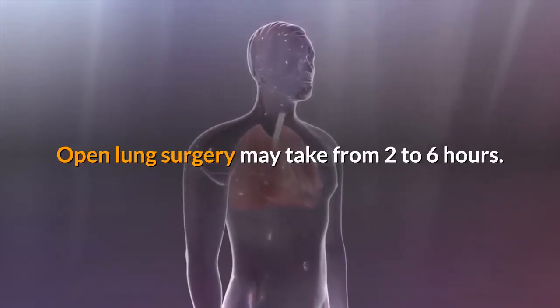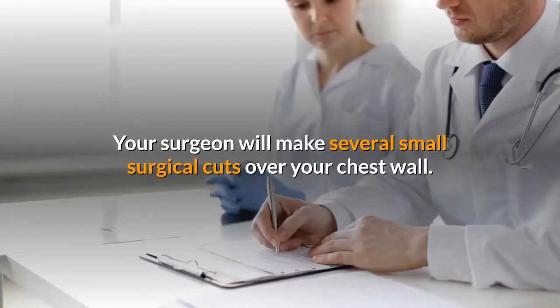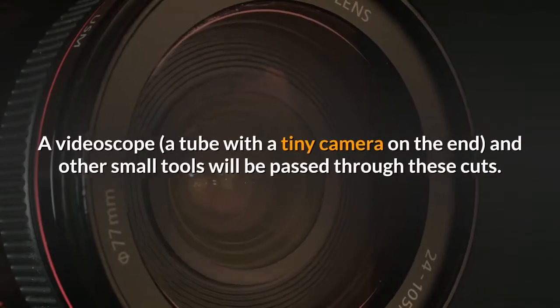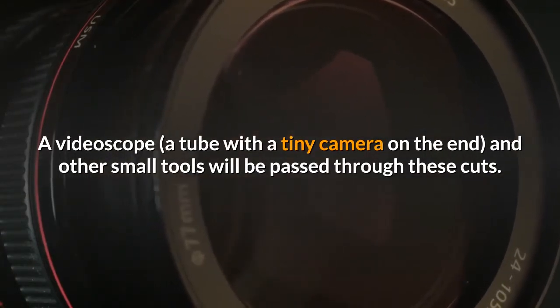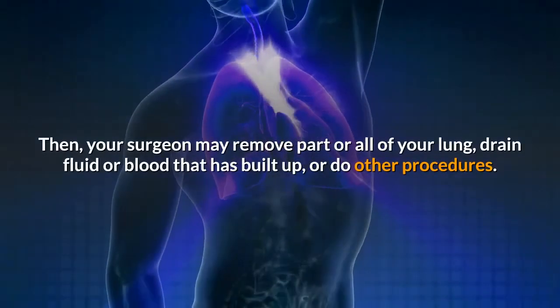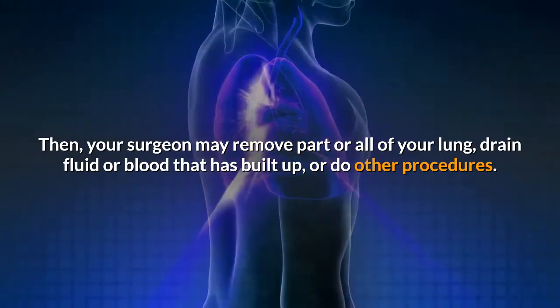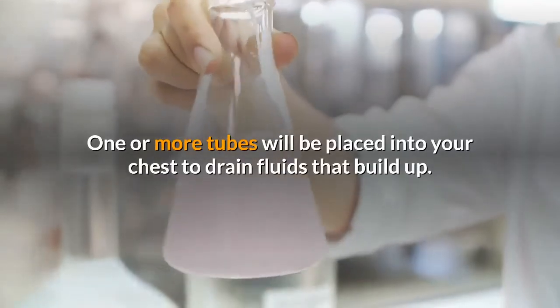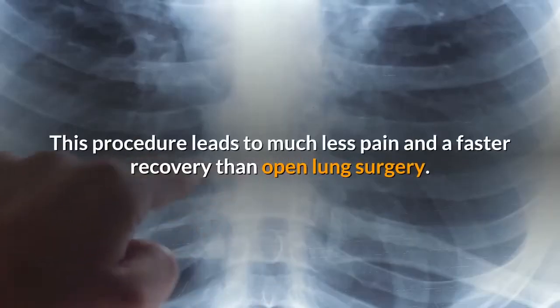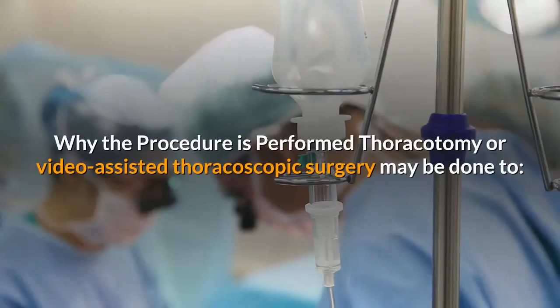In video-assisted thoracoscopic surgery, your surgeon will make several small surgical cuts over your chest wall. A videoscope — a tube with a tiny camera on the end — and other small tools will be passed through these cuts. Your surgeon may then remove part or all of your lung, drain fluid or blood that has built up, or do other procedures. One or more tubes will be placed into your chest to drain fluids. This procedure leads to much less pain and a faster recovery than open lung surgery.